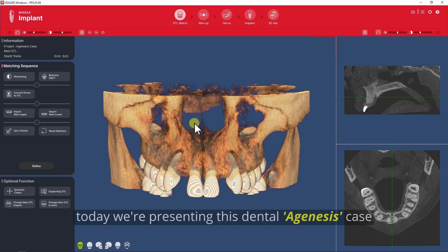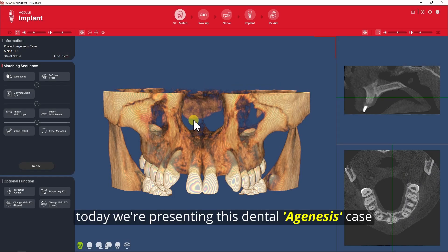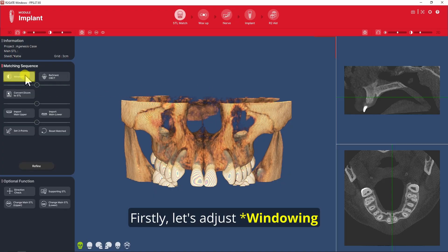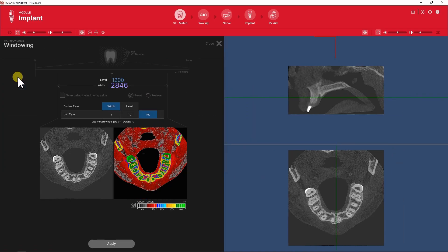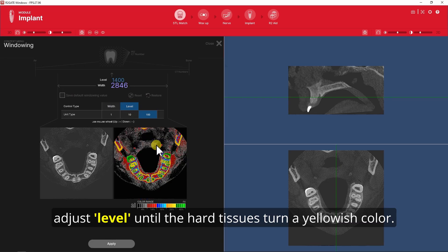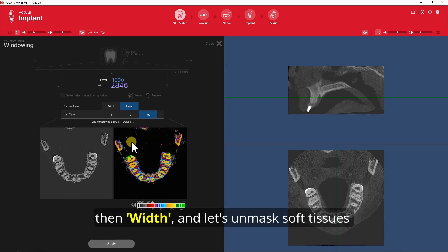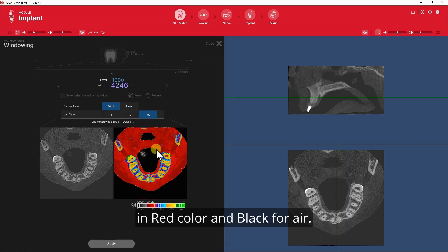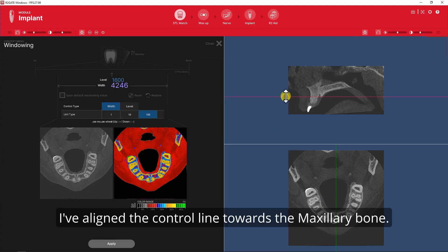Hello everyone! Today we're presenting this dental agenesis case for the anterior lateral incisors. Firstly, let's adjust windowing. Adjust level until hard tissues turn a yellowish color, then let's unmask soft tissues in red color and black for air.